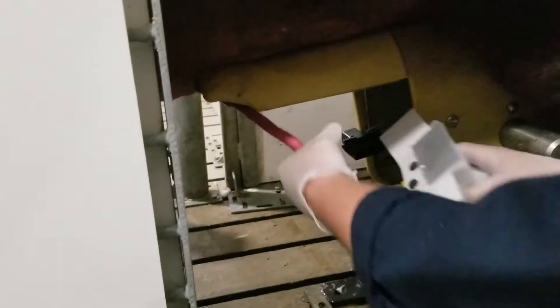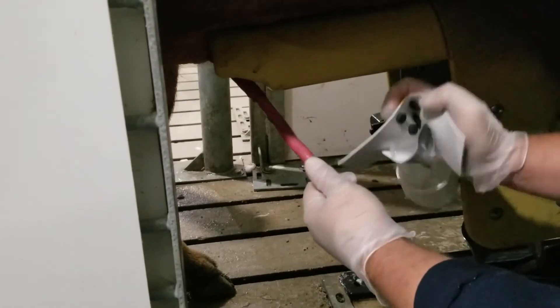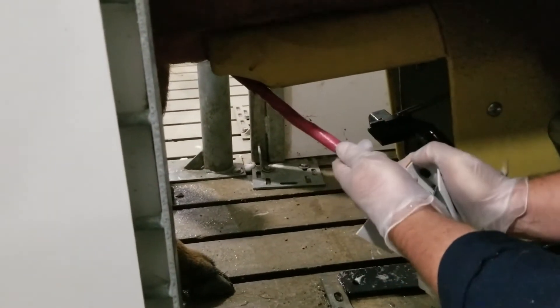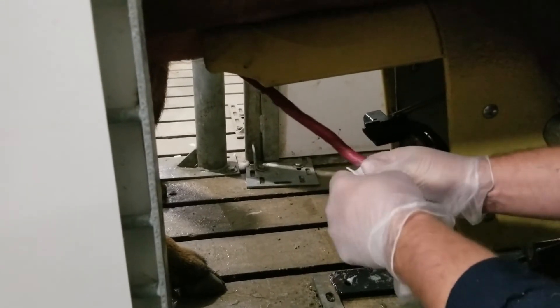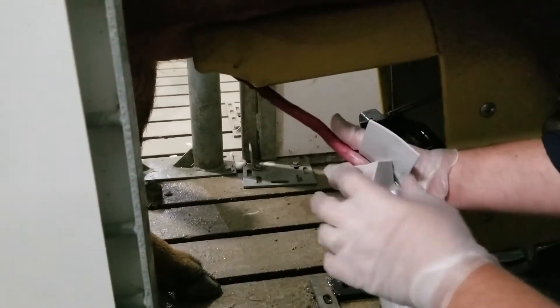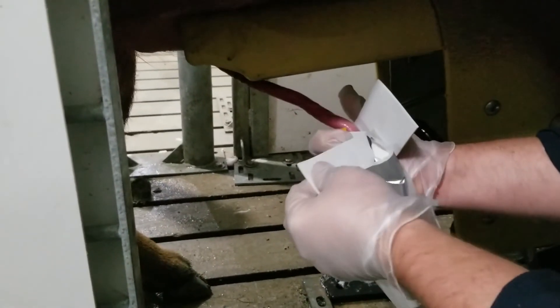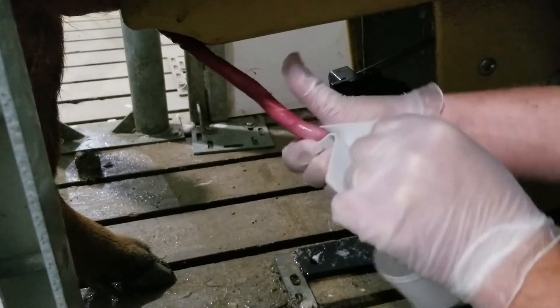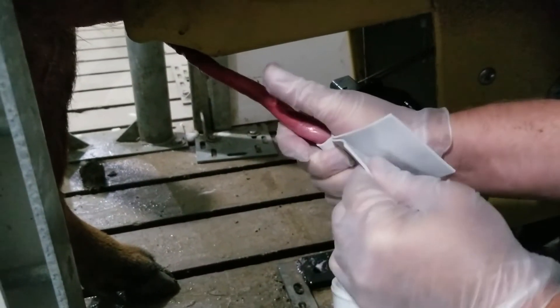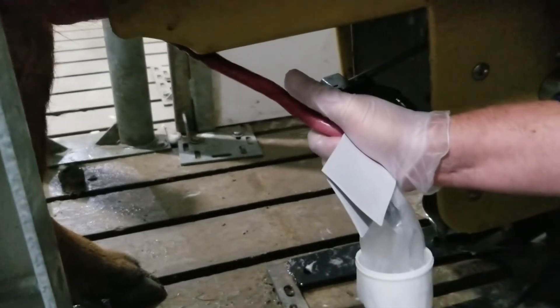I'm going to take the AC with the collar on it now and open that up. I'm going to take that AC and slide the penis into the AC. Now while I'm doing that I want to make sure that the penis went inside of the tape, and I've got it inside the tape and I'm going to roll these ears of the AC around and make sure that penis is locked up in tight.